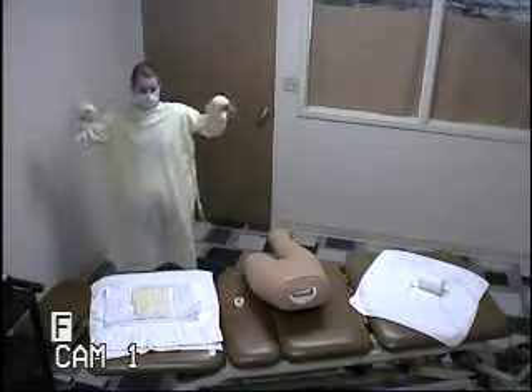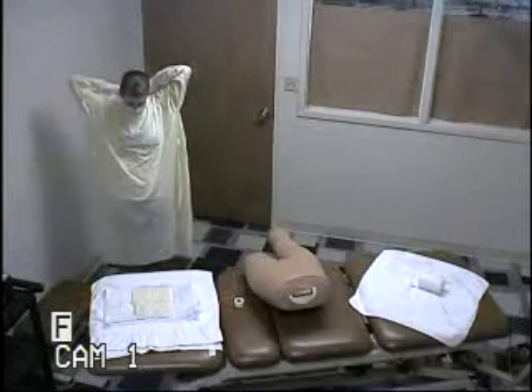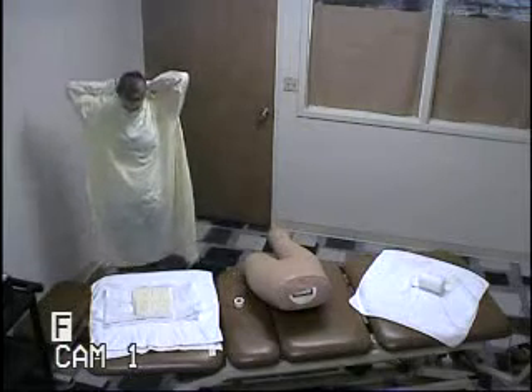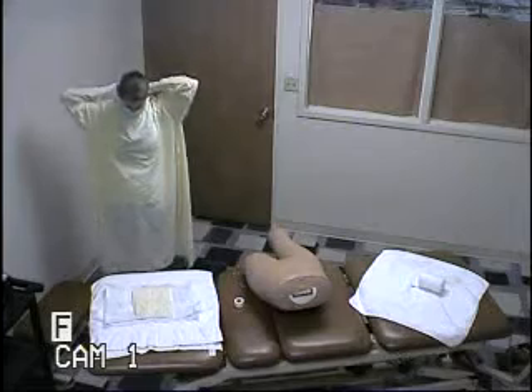My head didn't touch it. And I would have someone else tie my gown, but I'm going to go ahead and tie it since there's no one else in here. Behind my head.